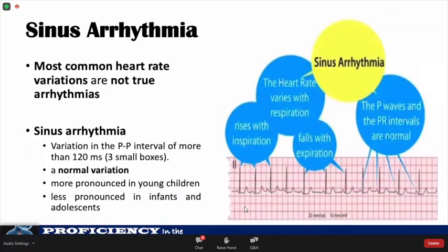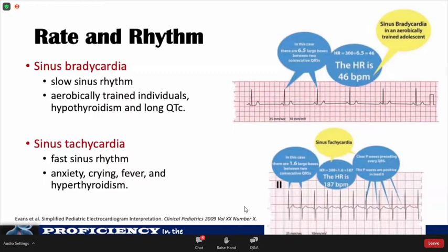Sinus arrhythmia is more pronounced in young children and less pronounced in infants and adolescents. Sinus bradycardia is a slow sinus rhythm seen normally in aerobically trained individuals, but also pathologically in hypothyroidism and long QT syndrome. Sinus tachycardia is a fast sinus rhythm consistent with anxiety, crying, fever, and occasionally hyperthyroidism.